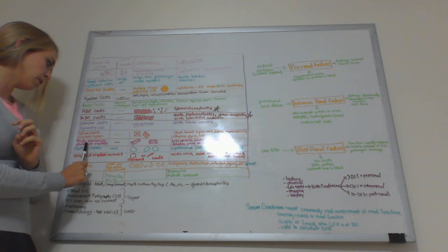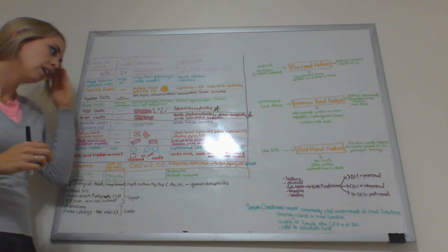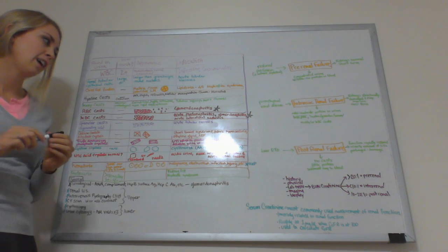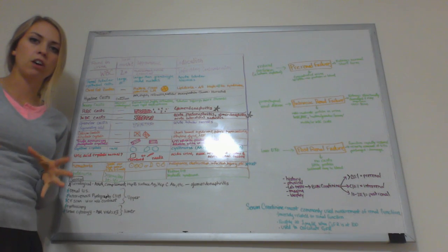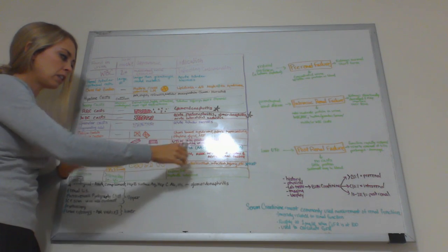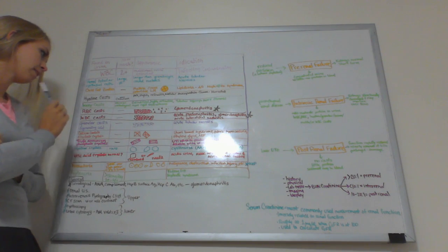Next we have the triple ammonium phosphate crystals. And these ones are a little more elongated, and they're called coffin-shaped crystals, or like a coffin lid. And those are pretty common with a UTI, if it's caused by a urease-producing bacteria. And they're also very common if you have an alkaline urine. So alkaline, think like a basic UTI, basic bacteria, coffin, because they're dead, I don't know, but triple ammonium.